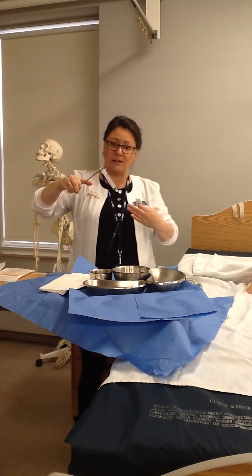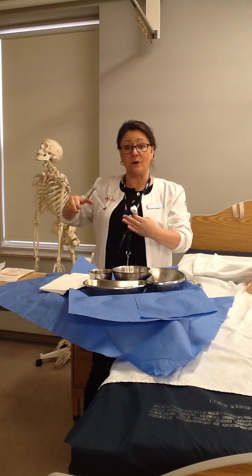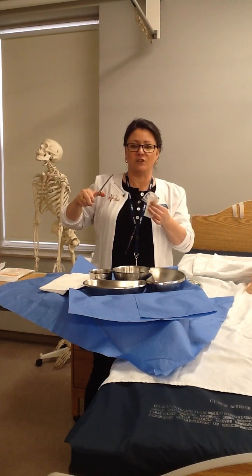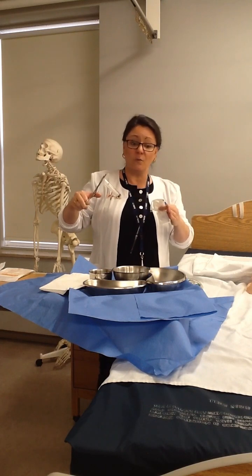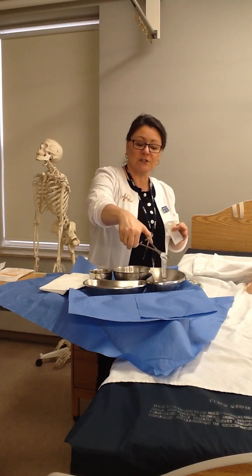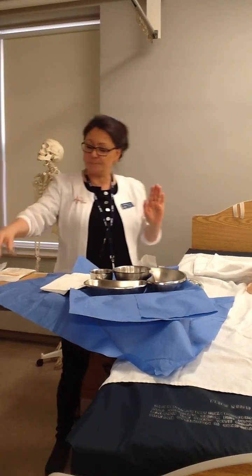You'll notice I'm standing away from my sterile tray. I would rather drop this whole thing on the floor and have somebody get me a new syringe than to drop the whole thing in that tray and contaminate the entire tray and have to start over. This 10 mil syringe can go anywhere you want. It doesn't matter. It can go into the emesis basin. I'm just going to drop it there for right now, no problem. Drop my garbage in there.